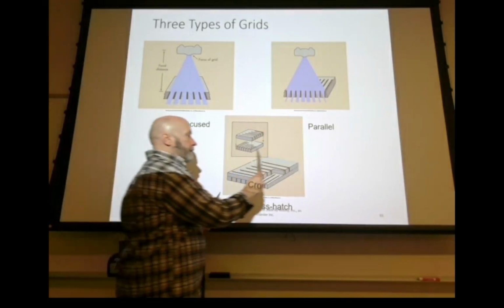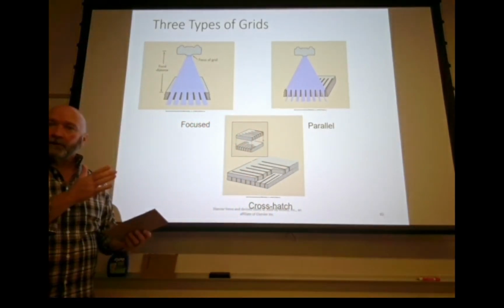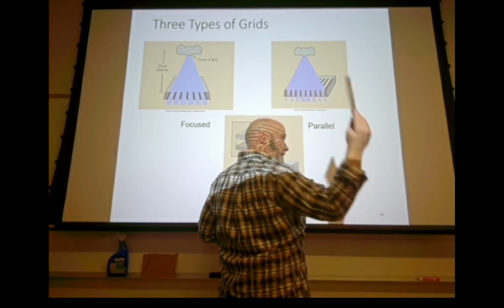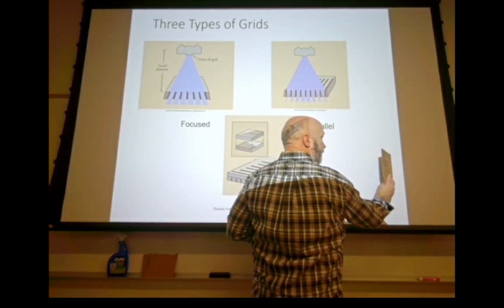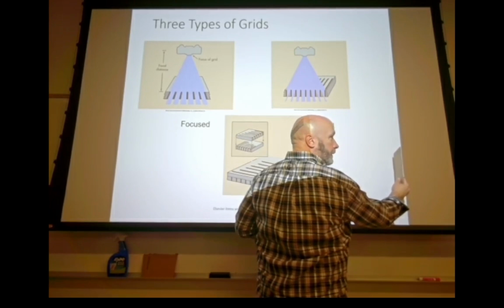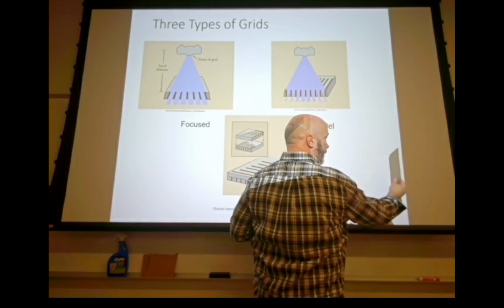Because those grid strips angle at specific angulations, if your SID is too close, those grid strips are angled out not quite as far as what the divergence of the central ray would want them to be. So you see grid cutoff in the periphery.